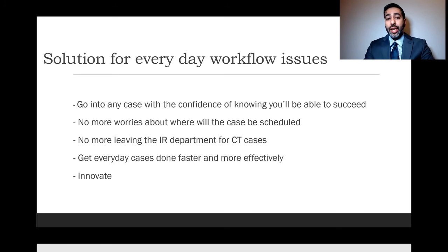Now it's just all in-house, and has been amazing innovations in workflow in regards to detecting submassive pulmonary embolism and bringing them straight from the emergency department into our lab, doing a quick CTA, and then confirming and then switching right over for catheter-directed thrombolysis. Cases get done more effectively, more efficiently.